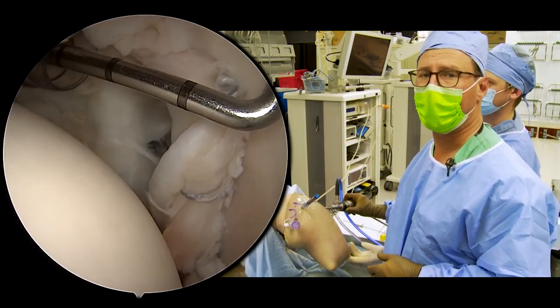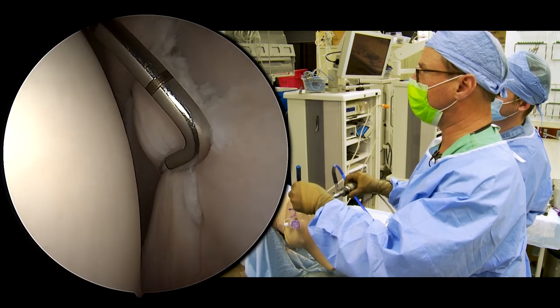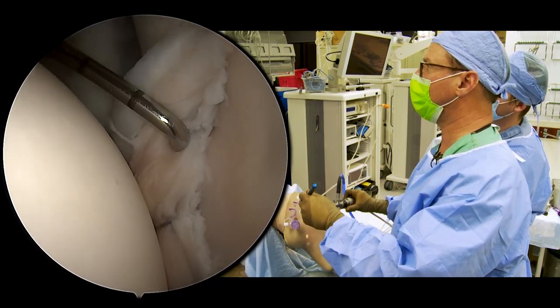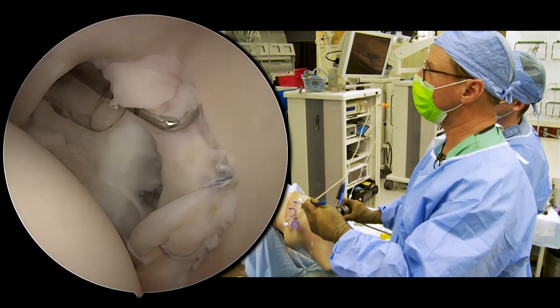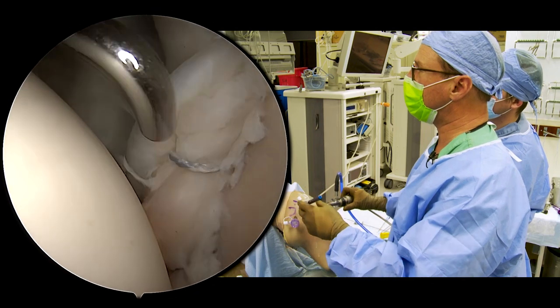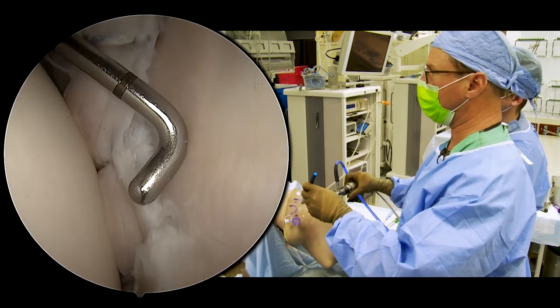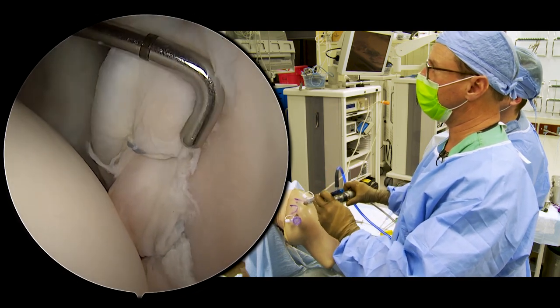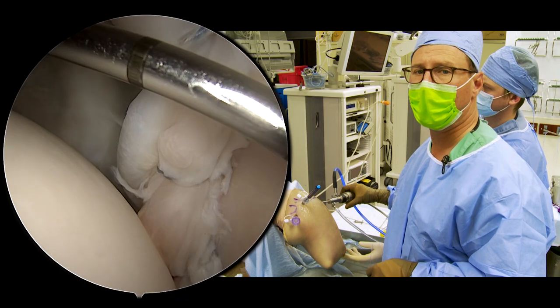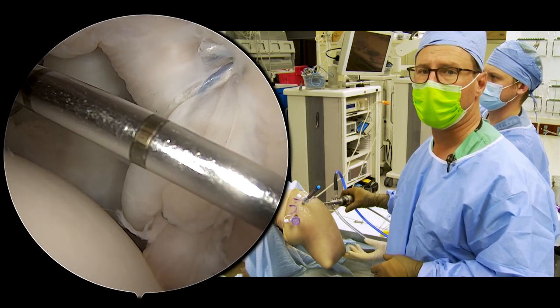Now we've completed our repair — we've put in two additional anchors. I typically use four, sometimes five anchors. The first anchor is low down at about the seven o'clock position, this is six o'clock right here, then seven, eight o'clock, maybe 9:30, and then one up here at about 10:30 to 11 o'clock. We could conceivably put another one up here for the superior labrum if it went into a SLAP. You can see how we've shifted the capsule up — we have very good tension. These anchors are nice in that they roll the labrum, creating a nice bumper, and they're low profile, creating very little risk of irritation of the joint. They're small 1.8 millimeter anchors, so they don't take away much bone. I hope these pearls help you in the care of your patients and in the use of these techniques for shoulder instability. Thank you very much.